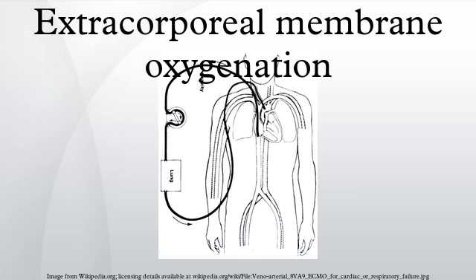Experiments on neonatal animals showed that ECMO treatment can lead to apoptosis of enterocytes, damage of the intestinal mucosal barrier and bacterial translocation. This might explain greater severity of systemic inflammatory response syndrome in neonates. Other uses. ECMO use on cadavers can increase the viability rate of transplanted organs. Societies. Extracorporeal Life Support Organization, www.elso.org, references.